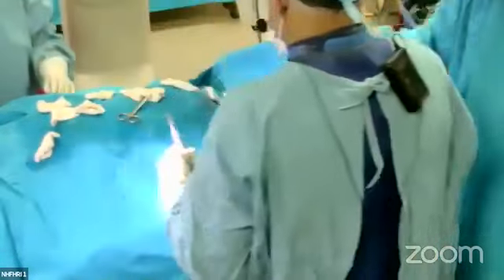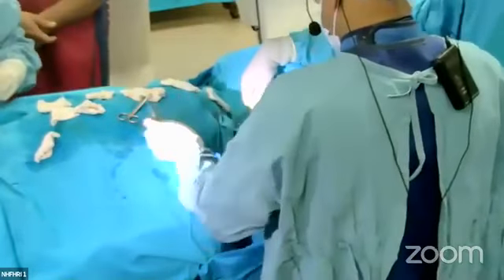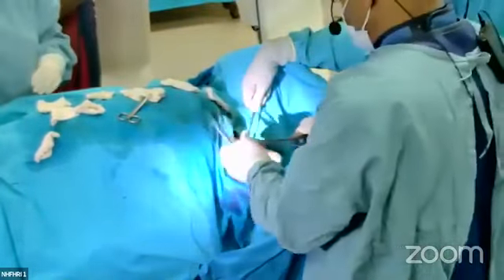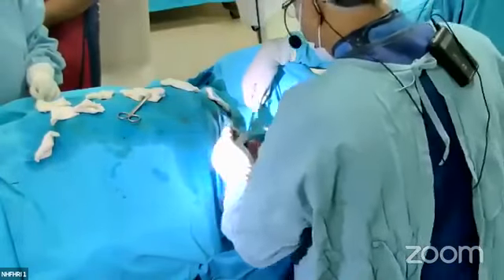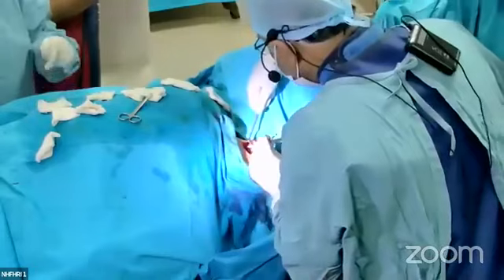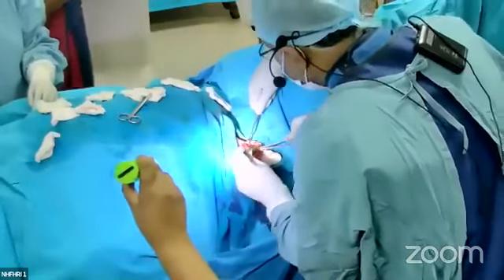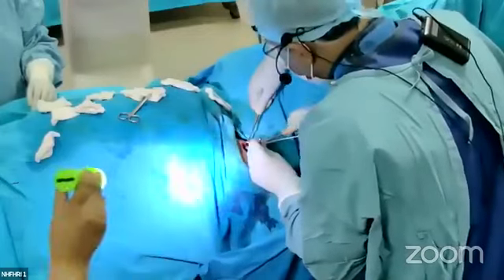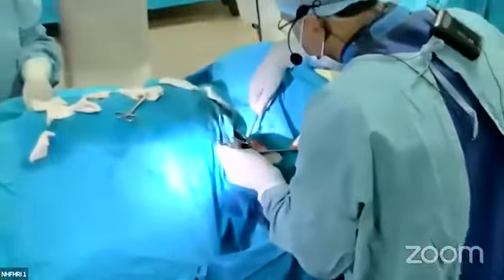Good. I have put the generator within the pocket. Light please. Focus on the monitor. Focus on the patient.